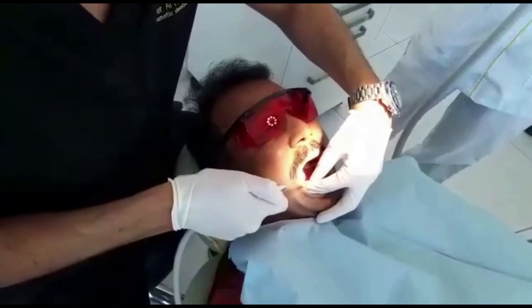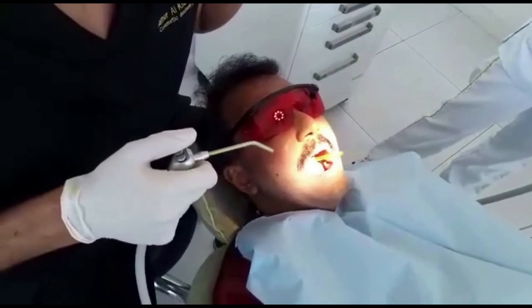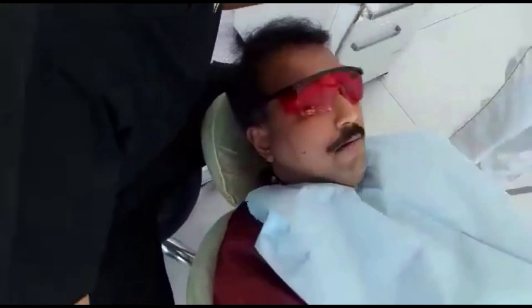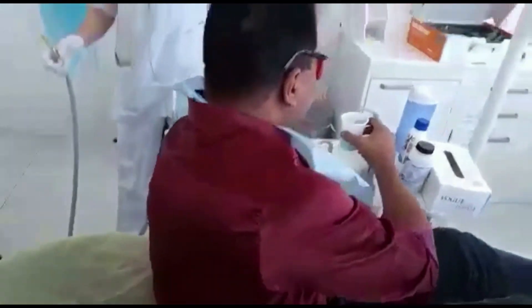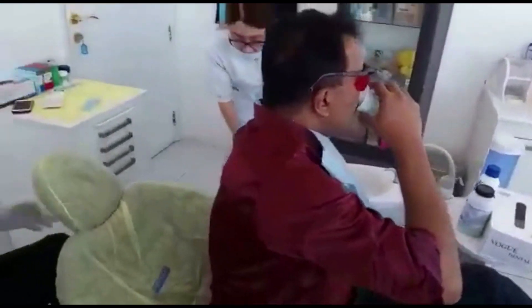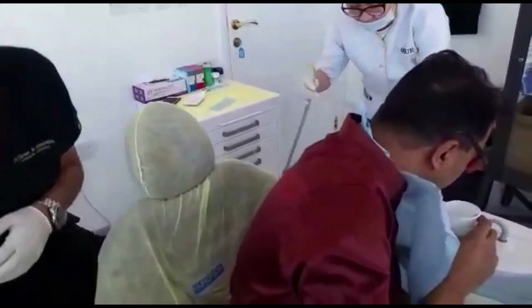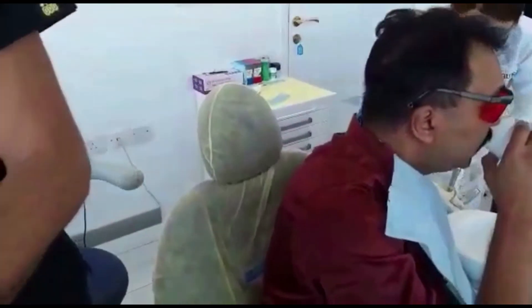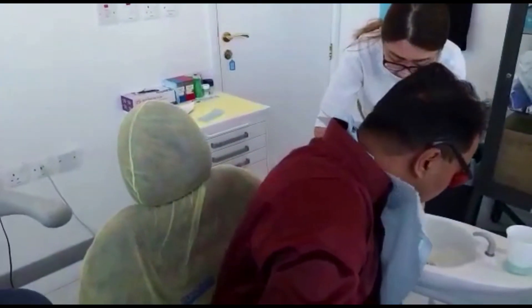I can do an extraction. Wonderful. Thank you. You have to tell me your experience.